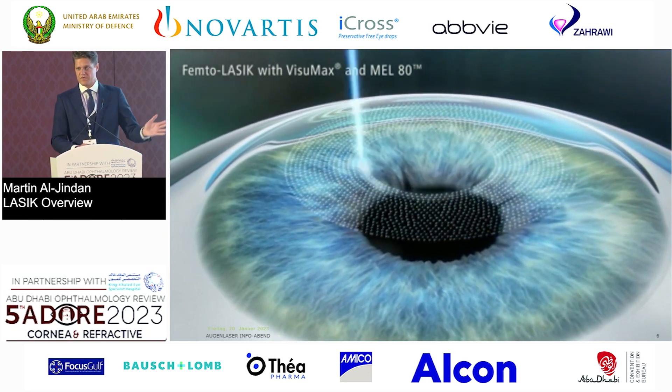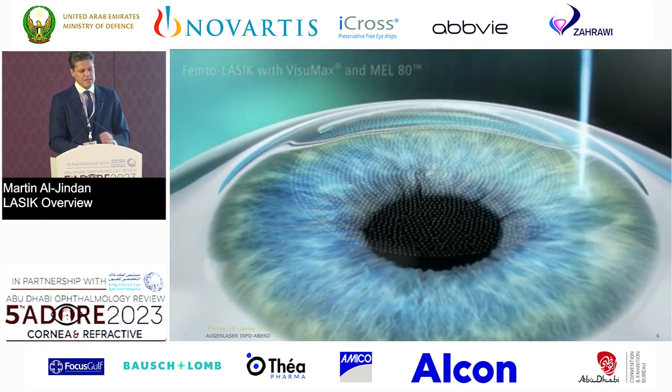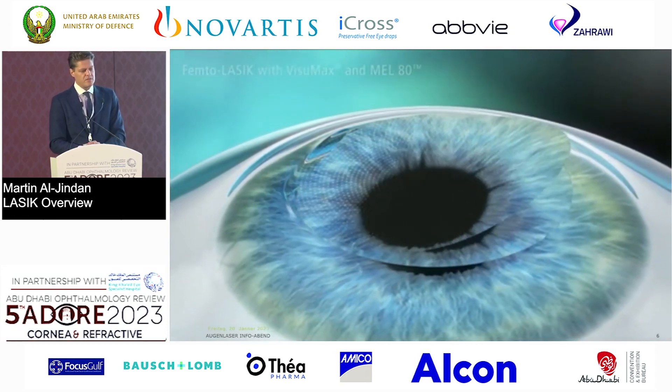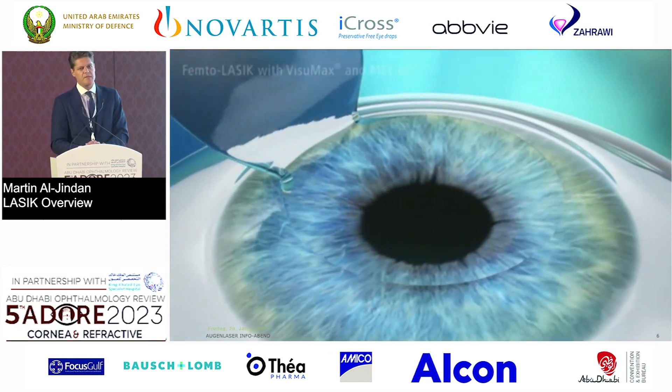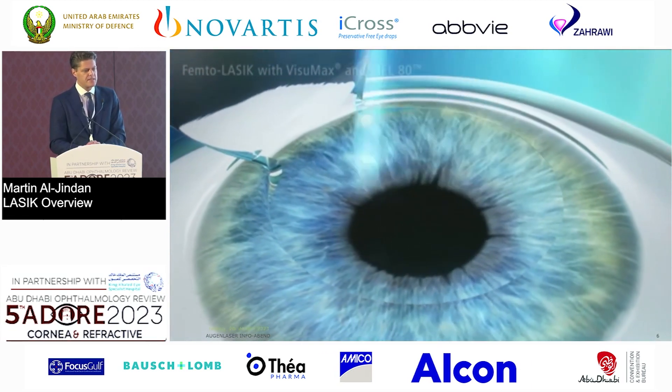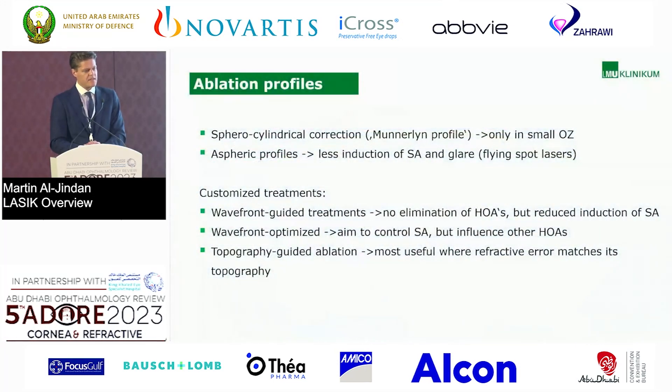You're all familiar with this procedure, I'm sure. I'm using the Zeiss VisuMax for the flap creation. If I do LASIK, I do approximately 110 microns flap thickness. Here's the ablation, and then we close the flap, and that's it.